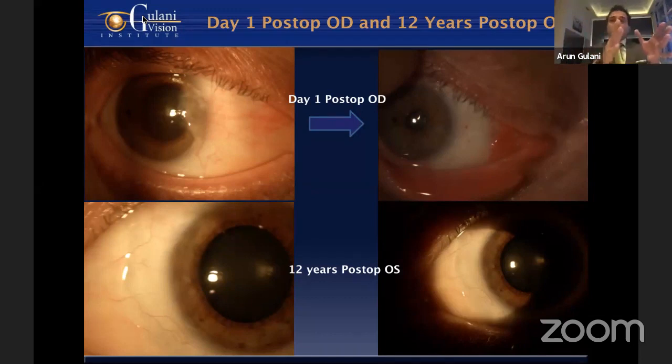Similarly here. All of you are excellent surgeons, especially I know you all are doing a lot of pterygium surgeries, but each patient, if you can take to a point where you bring them to the mirror next day, that's my desire for all of you. So I'll stop for a second now, take you to a video. I have many, many videos. Again, I'll cover everything as much as I can. Right now, I'll take you straight to one video, look at it, and then we'll go through some more slides.